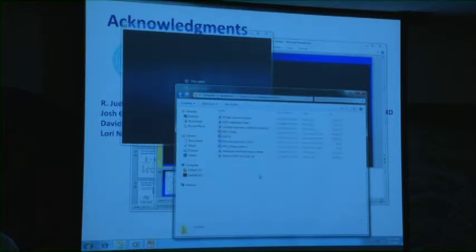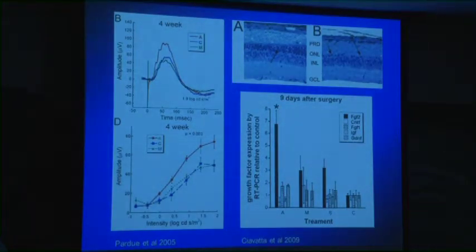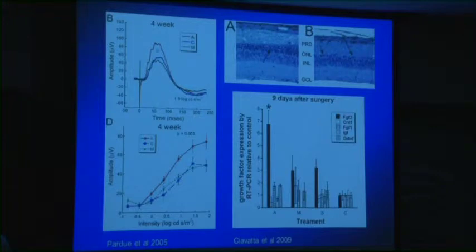All right. So we started investigating this effect, and we noted that we could also reproduce these effects in the animal models. This is the RCS rat, and here you can see in the implanted animal the preservation of the ERG B-wave activity compared to these two animals. One was a sham control, and one just had a minimally active implant.